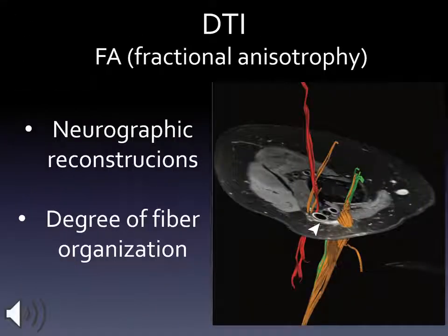The intrinsic structure of peripheral nerves involves the existence of several biologic barriers that facilitate water movement along the long axis of the nerve and restrict free water diffusion along the perpendicular axis. These features support the behavior of peripheral nerves at both DWI and DTI neurography.